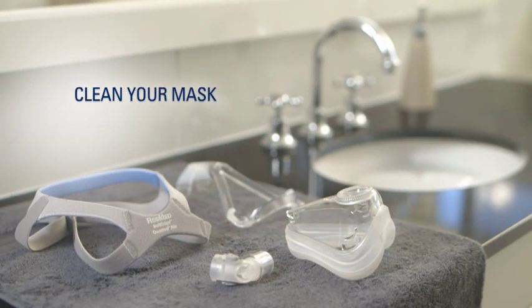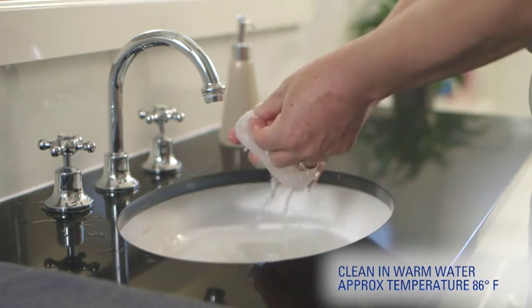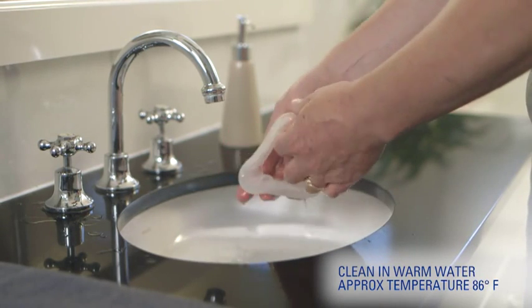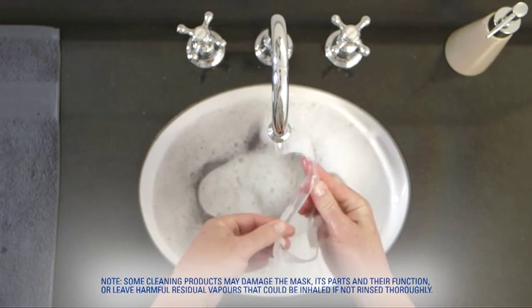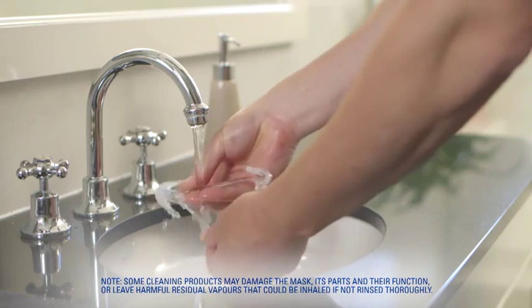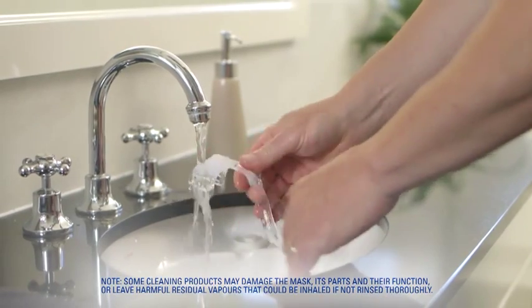Let's clean. Hand wash the mask cushion, frame and elbow daily by rubbing in warm soapy water. Always follow cleaning instructions and use mild soap, and rinse all components well afterwards.